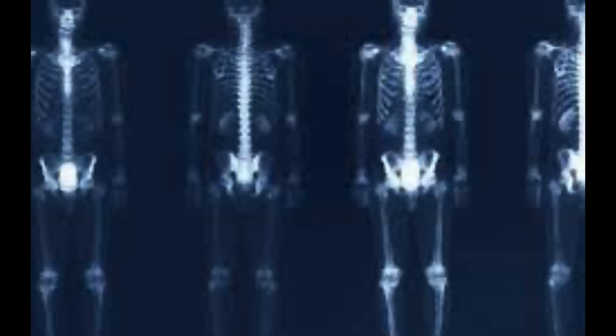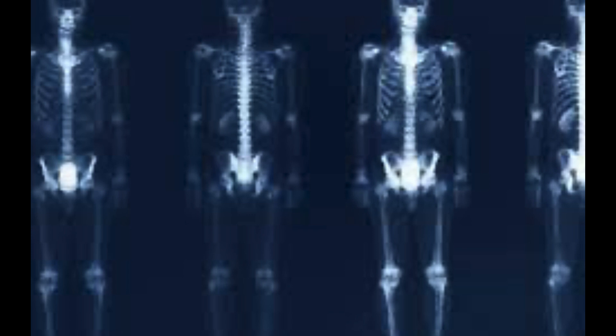For a whole body bone scan, we take pictures from the top of your head all the way down to your toes. Your head starts underneath the machine and gradually works its way out. The whole thing takes about 15 to 30 minutes depending on the speed of the camera. It's not like an MRI — it doesn't make a lot of noise; the camera is very quiet. There's no radiation coming out of the camera — you are the radiation source. That injection of MDP or HDP has no side effects. It's not a contrast dye, so you won't feel any different.